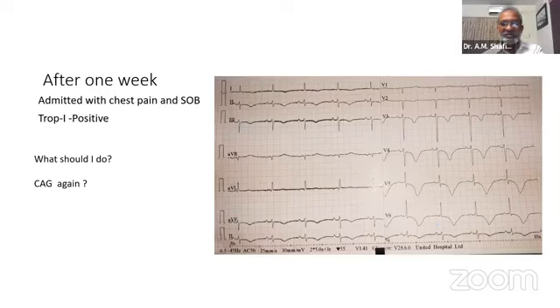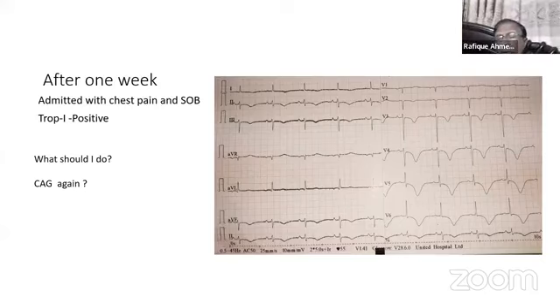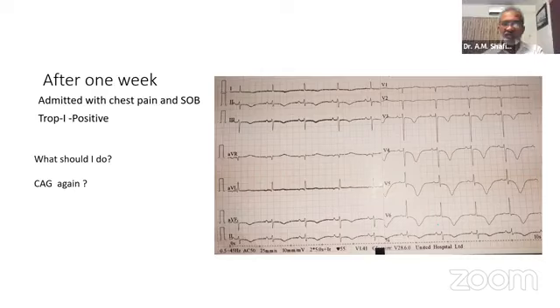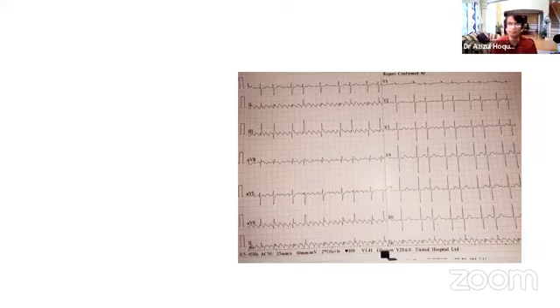This is the ECG. Patient admitted again. So, did the patient go home on any antiarrhythmic, amiodarone? No sir, the patient was on a beta blocker. Any anticoagulation? Anticoagulation the patient was getting, right, sir. And no neurological symptom? No neurological symptom. The patient is very conscious, oriented. Do you have any previous EKG from the previous admission one week before? This is the EKG. It's okay. Right.